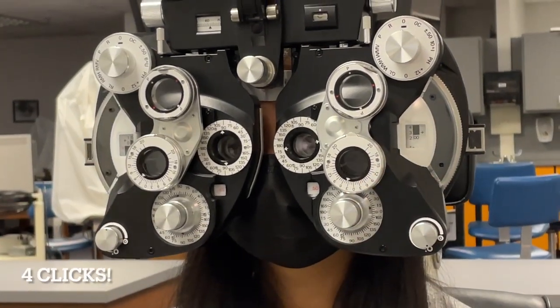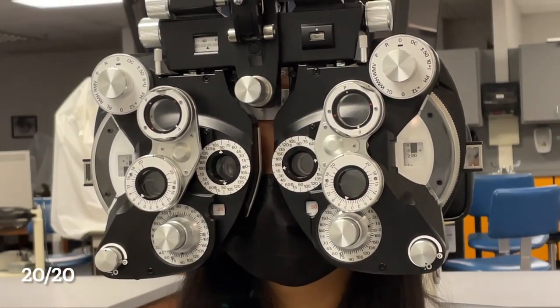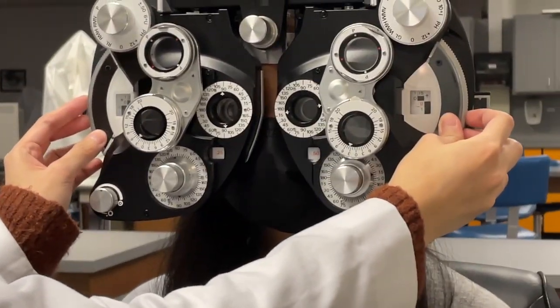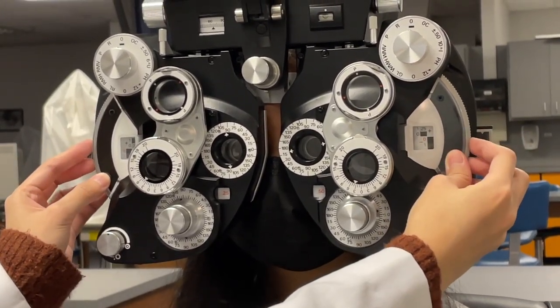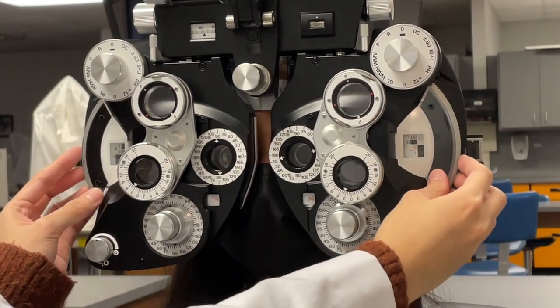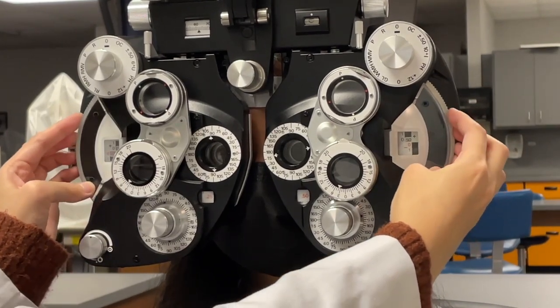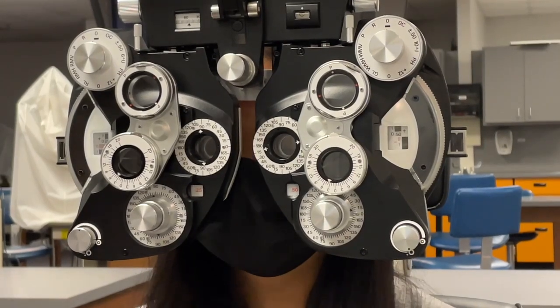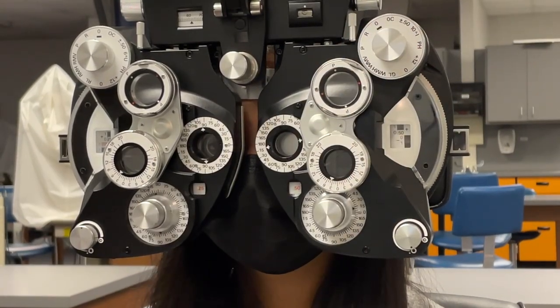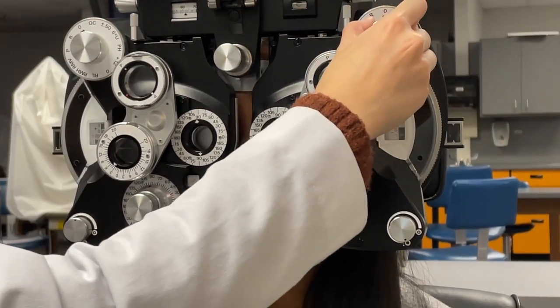All right, I'm gonna change the line back to 20-20. We're gonna do the exact same thing we did earlier. I'm gonna slowly remove these lenses, and you let me know when you can just see 1 or 2, but nothing more. I see an L. Okay, where's the L? The second letter. Good. And then can you read that line for me? RLCPKD. Okay, can you read that with one eye? Yep, RLCPKT. Good, and then this eye, can you read it backwards for me? Yep.